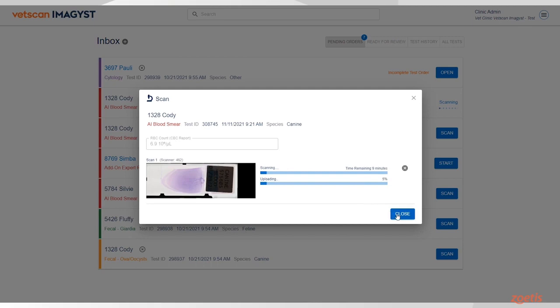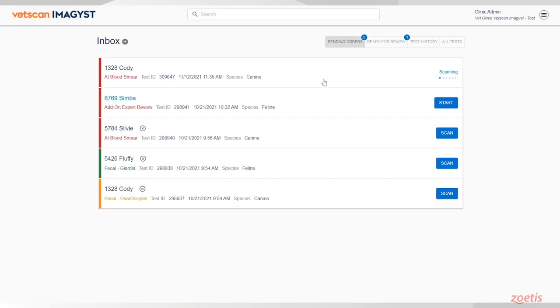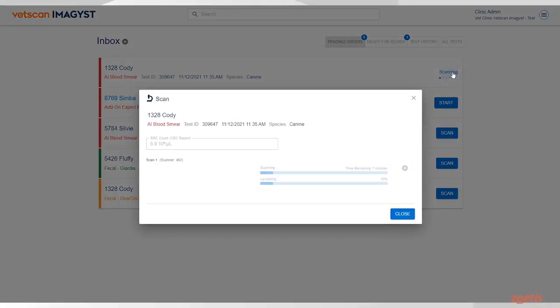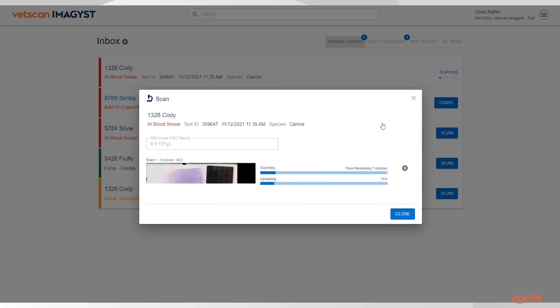Click Close. Your test order has now been submitted. The test status can be seen in the Inbox in the Pending Orders section.